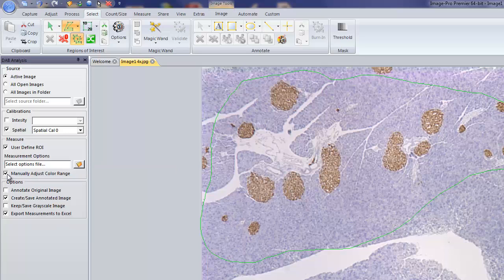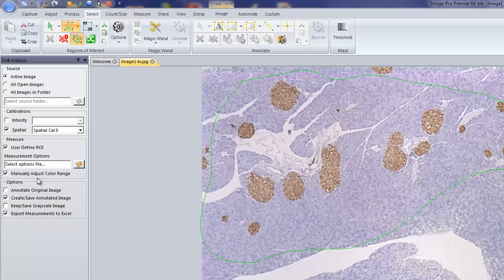we can also, by using the checkbox here, manually adjust the color range. So in essence, we can resegment or resample the color to select the proper color and give you the proper segmentation.